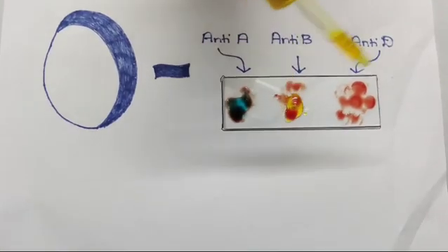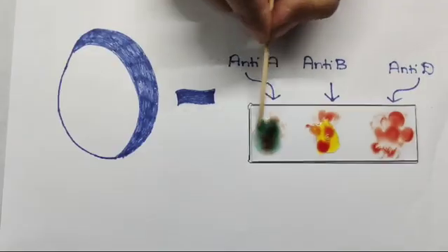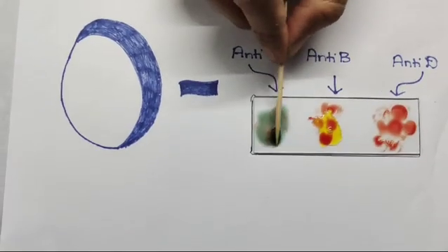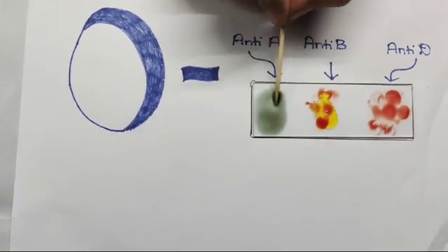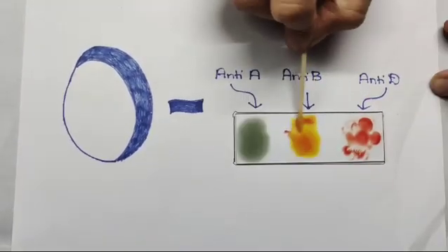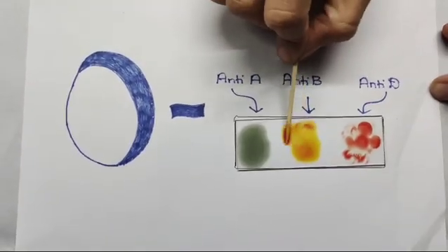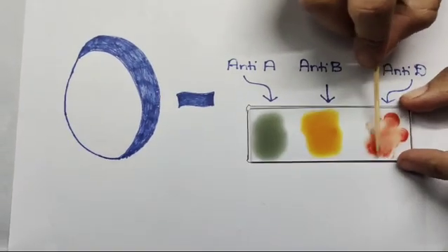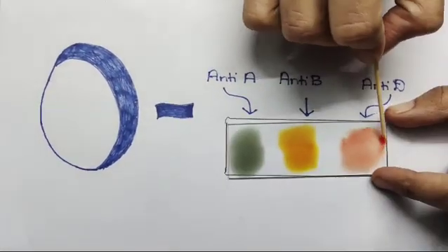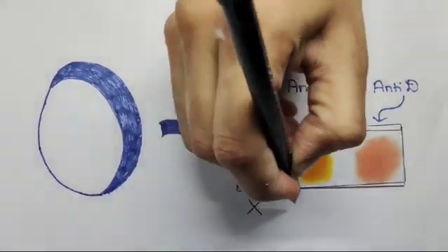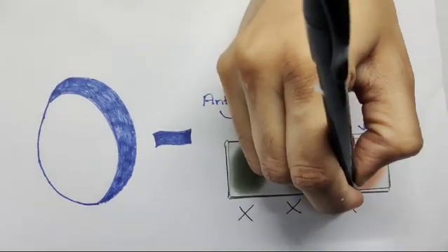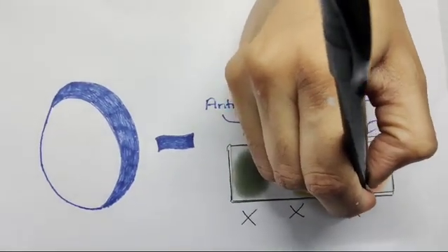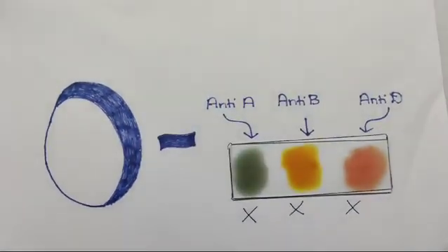No clotting will be seen in anti-D also, which means Rh antigen is absent. It is a negative blood group. Hence, the blood group determined is O negative.